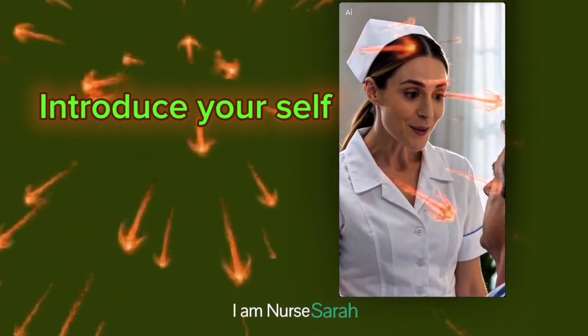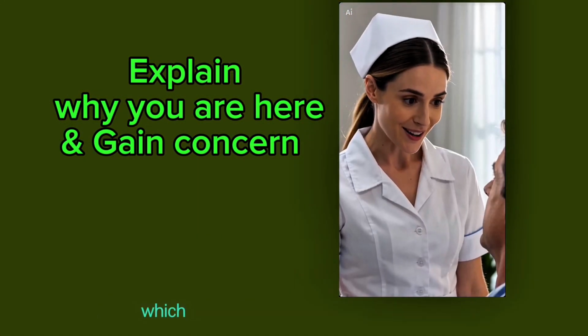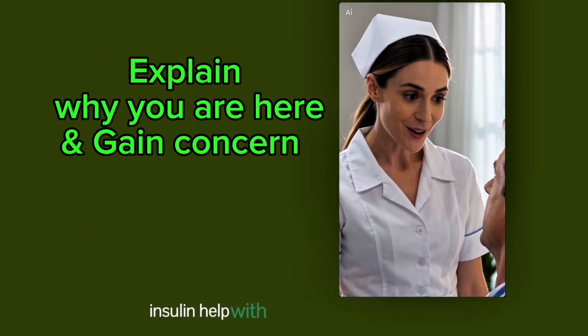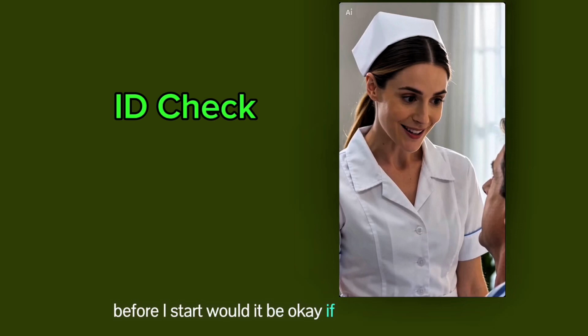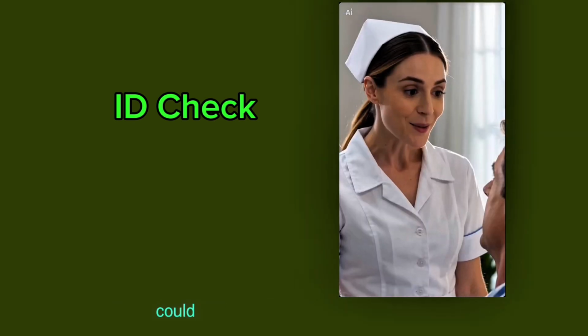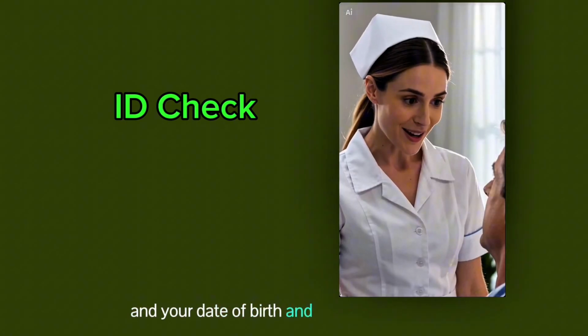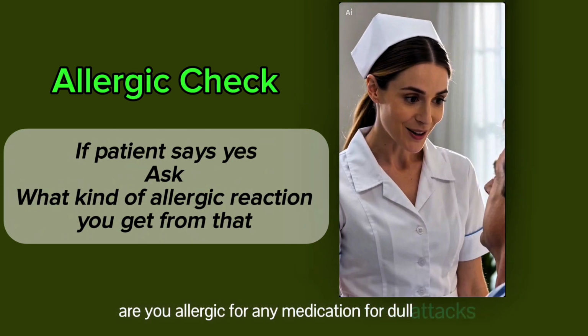Hi, I am Nurse Sarah. I'm here today to give you your subcutaneous injection, which is your insulin. Is that alright with you? Insulin helps with your blood glucose level. Before I start, would it be okay if I just check your ID? Can I touch your wristband? Could you please tell me your full name, your date of birth and your address please? Are you allergic to any medication, food or latex?